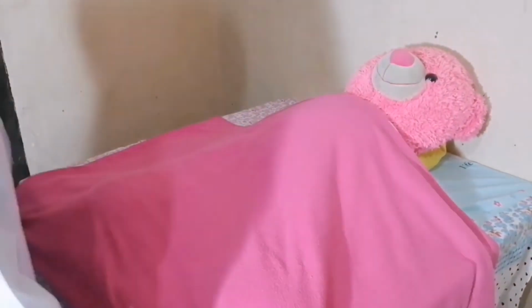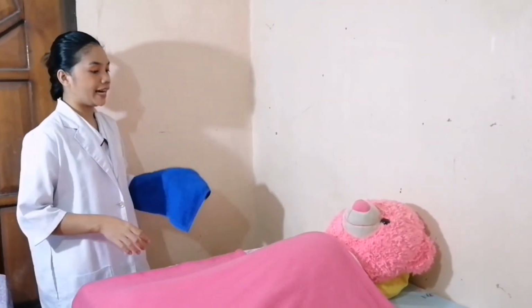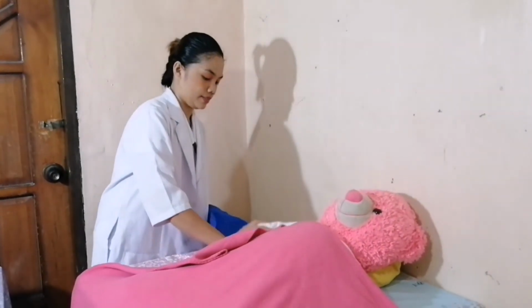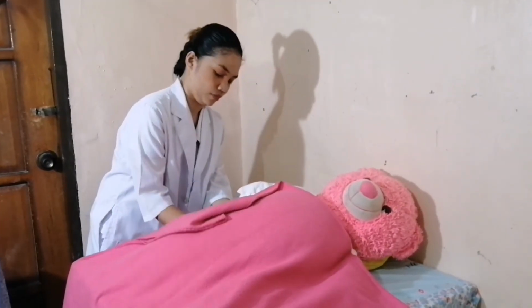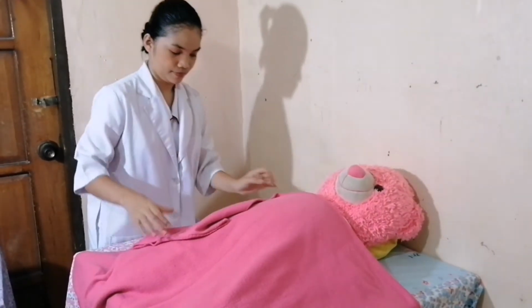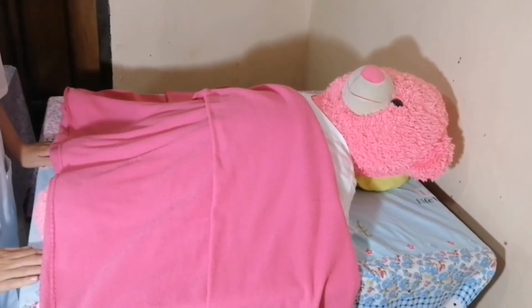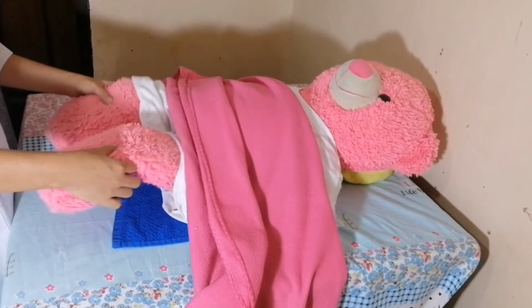Okay, other side. The next procedure is to place the client in a dorsal recumbent position with the feet apart and drape the client.